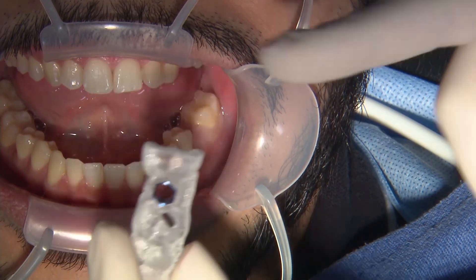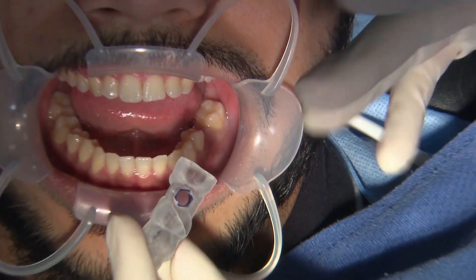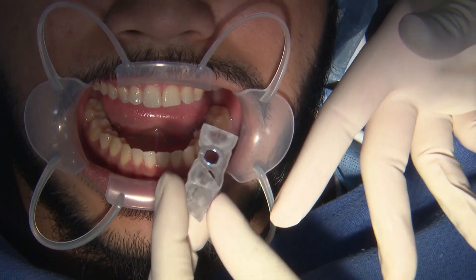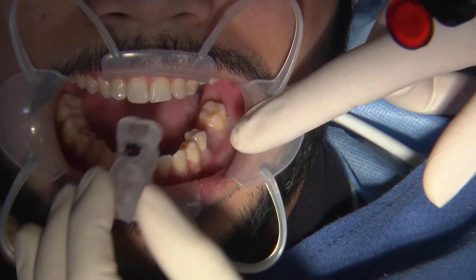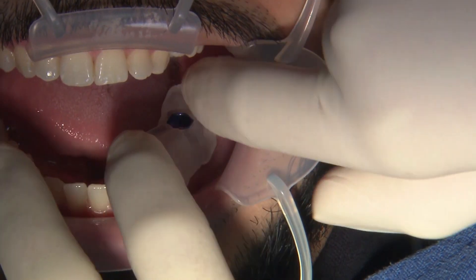Now we're going to try in our surgical guide. For my purpose, I always like to bring the patient in before the day of surgery to try in the guide and make sure that it fits. So today we're going to try it in again just to show you guys the fit.